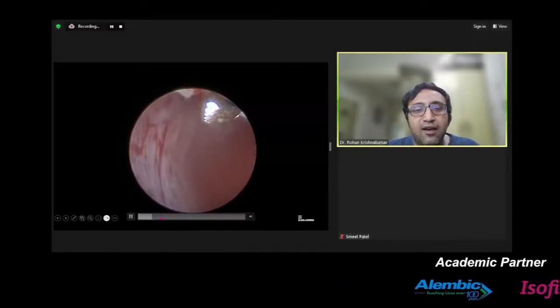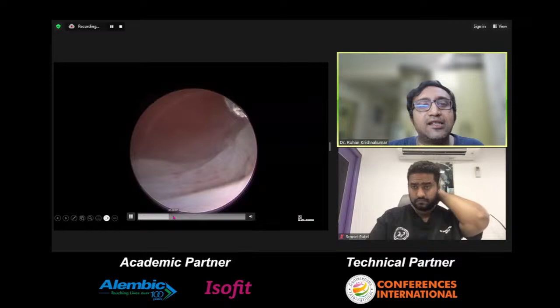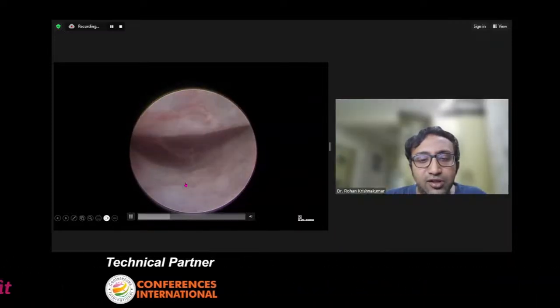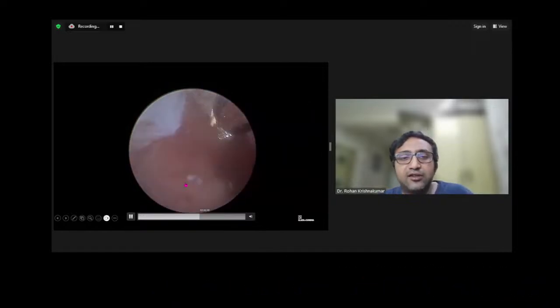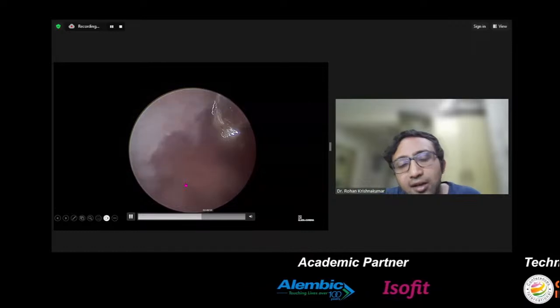So with this, we morcellated with this tissue retrieval system the entire GSAC. You can see clearly. I'll just show you once the procedure is done. This will, of course, bleed because the contents of the sac will also keep coming out. You can see without touching any other part of the endometrium.